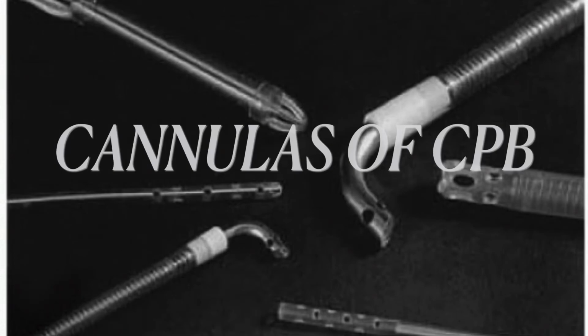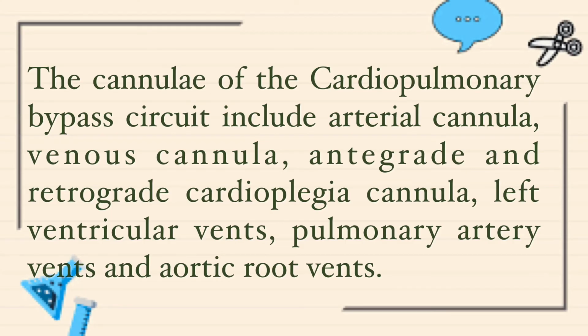Cannulas of cardiopulmonary bypass. The cannulas of the cardiopulmonary bypass circuit include the arterial cannula, venous cannula, antegrade and retrograde cardioplegia cannula, left ventricular vents, pulmonary artery vents, and aortic root vents.